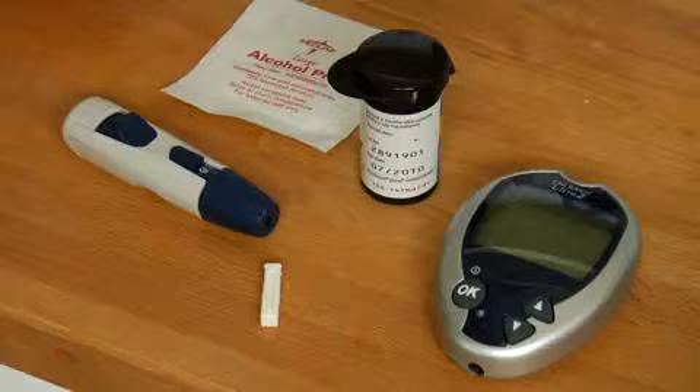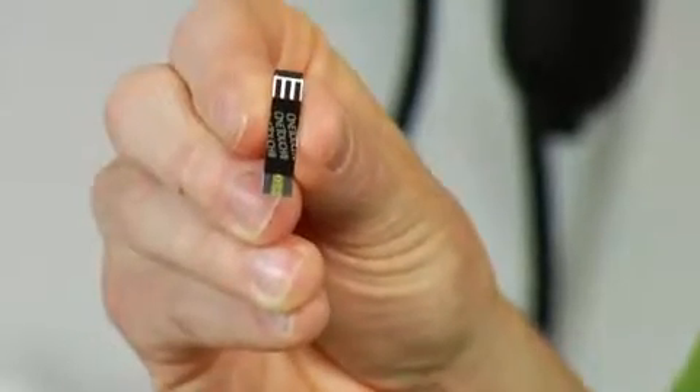What you want to do is have all of your supplies ready. If you are getting a new bottle of test strips, you want to make sure that your monitor is coded with the code on the test strips — that's important to do when you turn your monitor on.